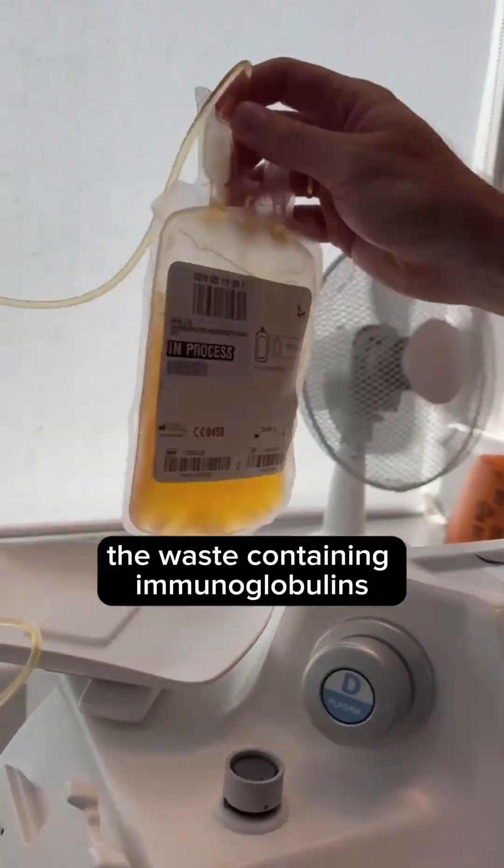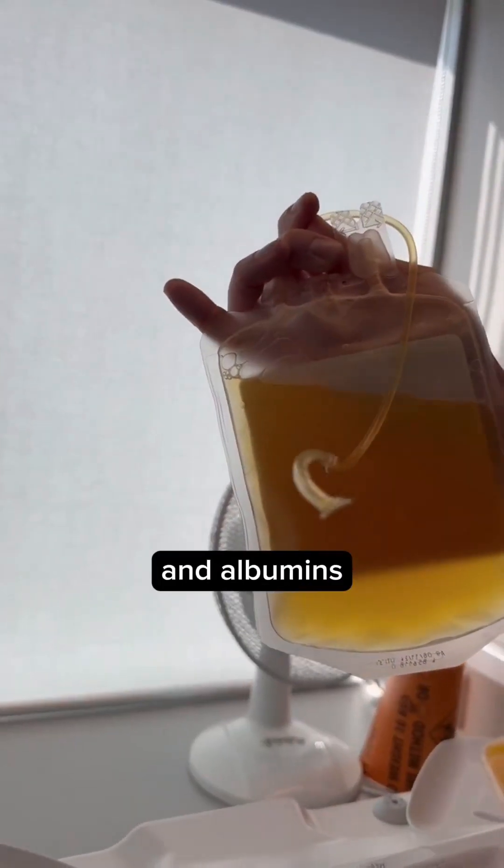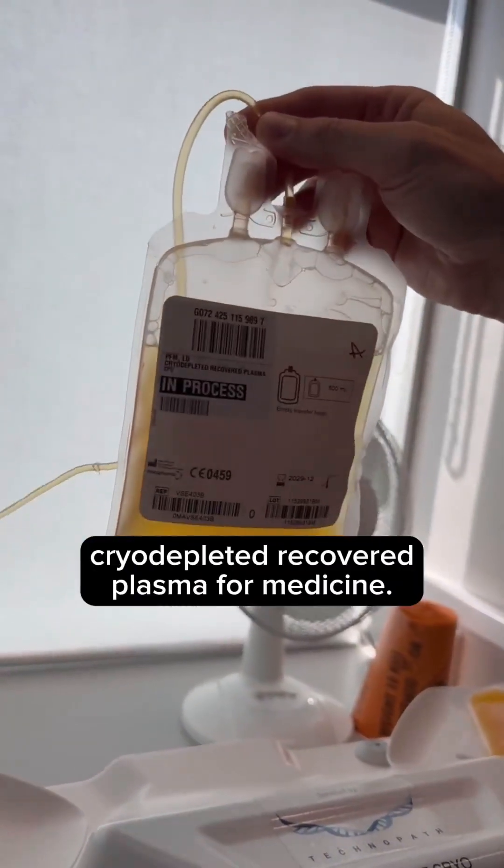However, the waste containing immunoglobulins and albumins is going to be used as cryodepleted recovered plasma for medicine.